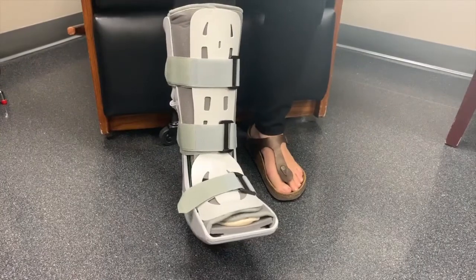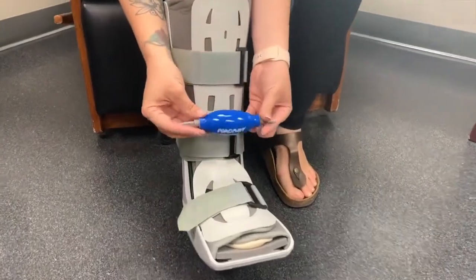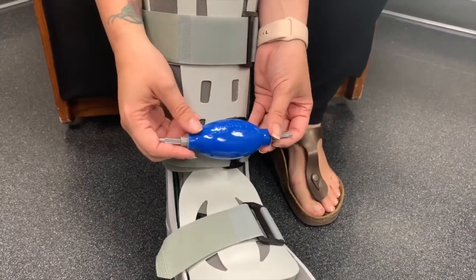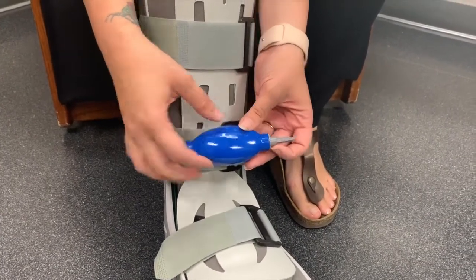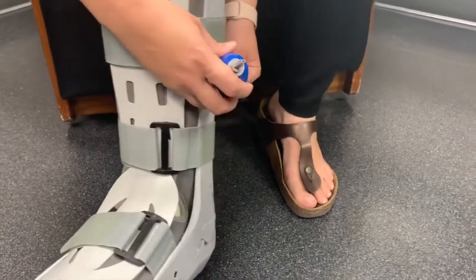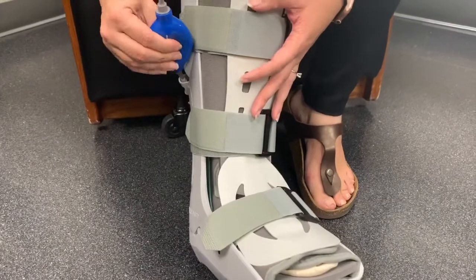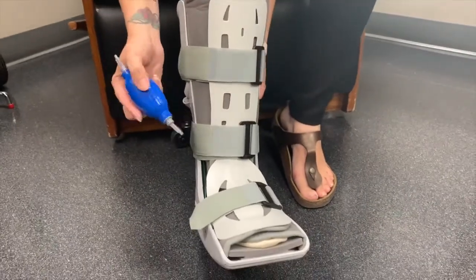You may have to pump up the boot using this pump. It's marked inflate and deflate on both sides. To inflate the boot, use the inflate portion on the port and start with one or two pumps. To deflate, you would do the same.